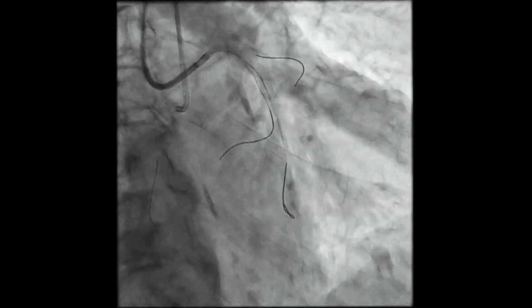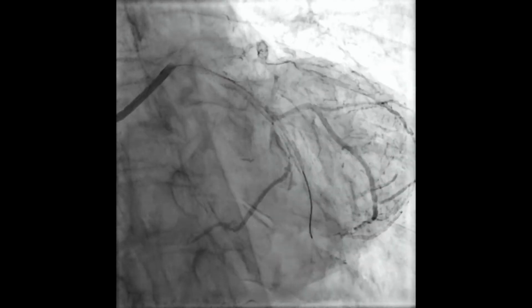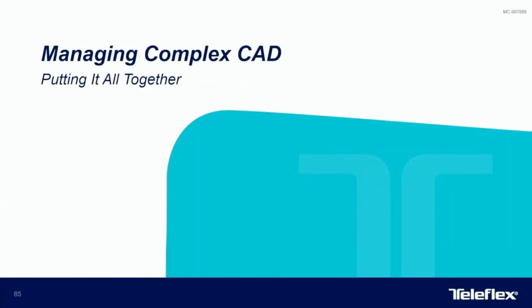So imaging as usual. And overall, a good angiographic result was obtained here. We did go back and touch up that OM that was pinched with our work.